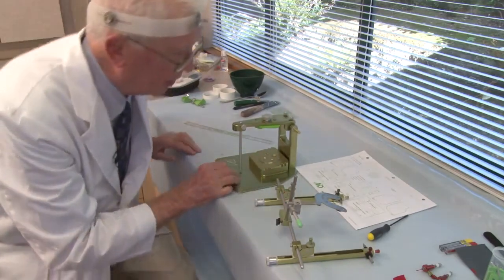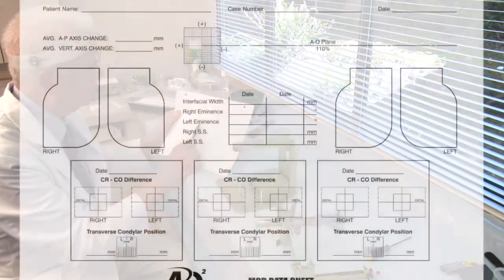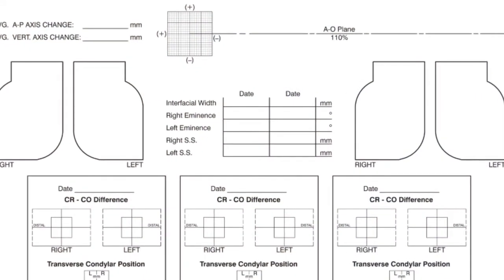So we go to our patient records. We can see that it says interface width, the date, and the actual millimeter measurement. So we record the patient's interface width, 137 millimeters.